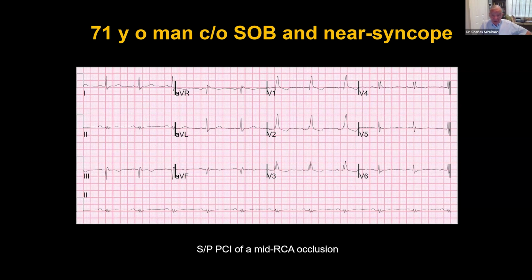So what is the relationship of right coronary occlusion to an acute inferior STEMI? Somebody want to answer that in the chat? You can type right into the chat box. Okay. No takers? No takers.